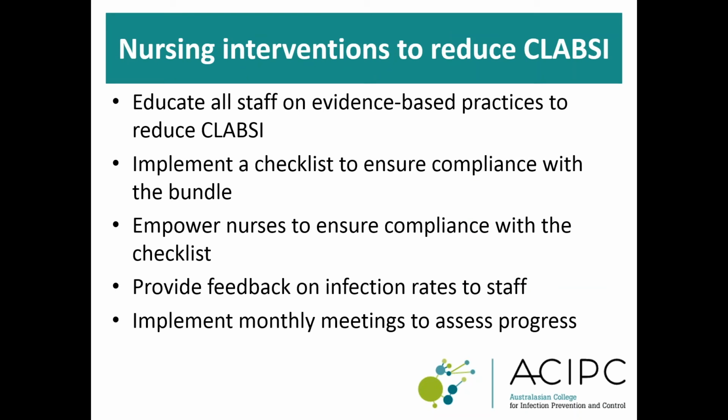When implementing a bundle of evidence-based practices, you also need to educate staff on all the elements of the bundle, implement a checklist to ensure compliance with the bundle, and empower nurses to speak up if they witness any breach of best practice. It's also important to provide feedback on infection rates to staff and hold monthly meetings to track progress and keep staff engaged with the quest for preventing infection.